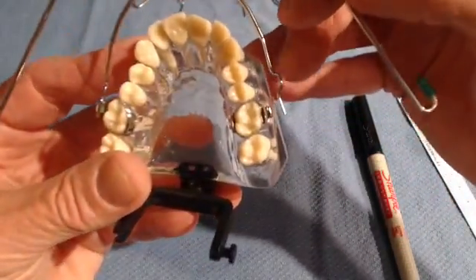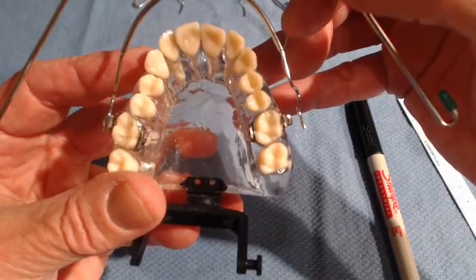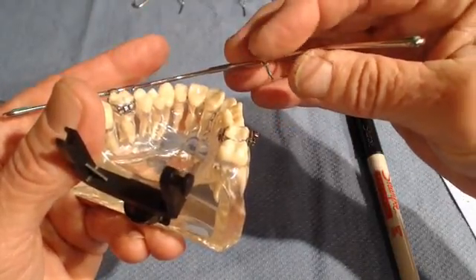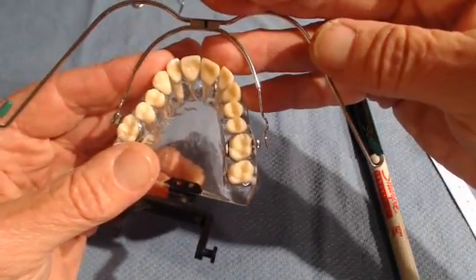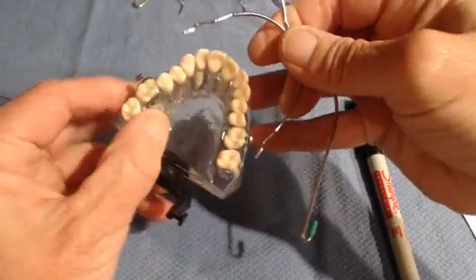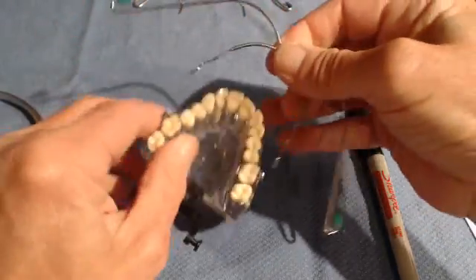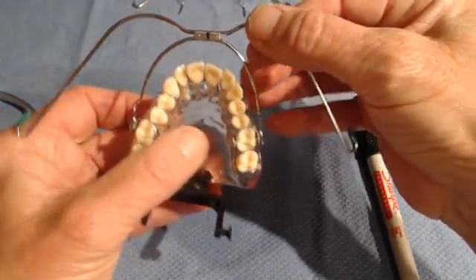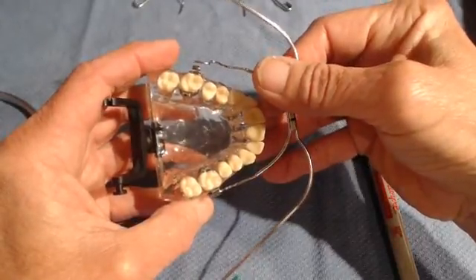On the patient's right side, the inner bow is about 6 millimeters away from the tube. The desired amount of expansion is only 1 to 2 millimeters — the diameter of that wire is 0.045, and 1 millimeter is 40 thousandths of an inch, so approximately 45 is close to 40, meaning it's about 1 millimeter. Simply compress the inner bow until you have one wire width away from the tube. I compressed too much, so expand it back out — there you go, one millimeter away from the tube. When you insert it, it will go in as smooth as glass.